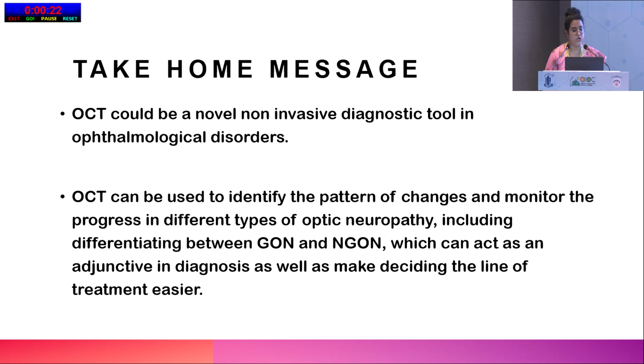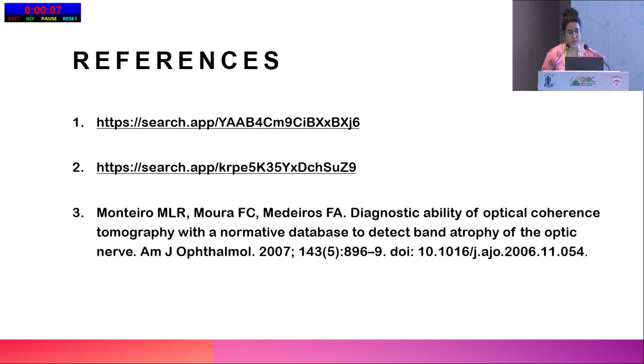So my take-home message is that OCT can be a novel, non-invasive diagnostic tool along with the clinical findings to differentiate between the NGON and GON category of RNFL thinning, and it can also help to plan our treatment accordingly. So these are my references.